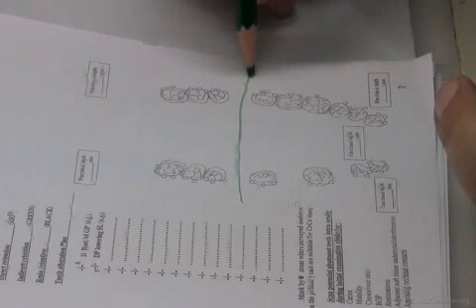What do we have in this case? Once more, the junction between the upper and the lower. We're talking about the upper now. What's the Kennedy classification of this case? Class 4. Kennedy's classification is class 4. Support classification. Now this is tooth tissue. How many teeth are missing? A lot, right? More than 10 teeth. So this means this is a tooth tissue.